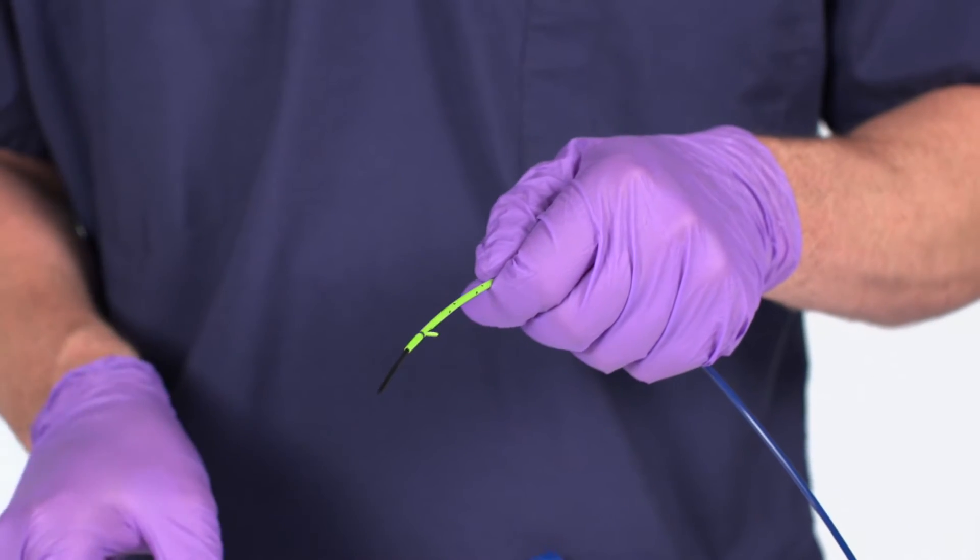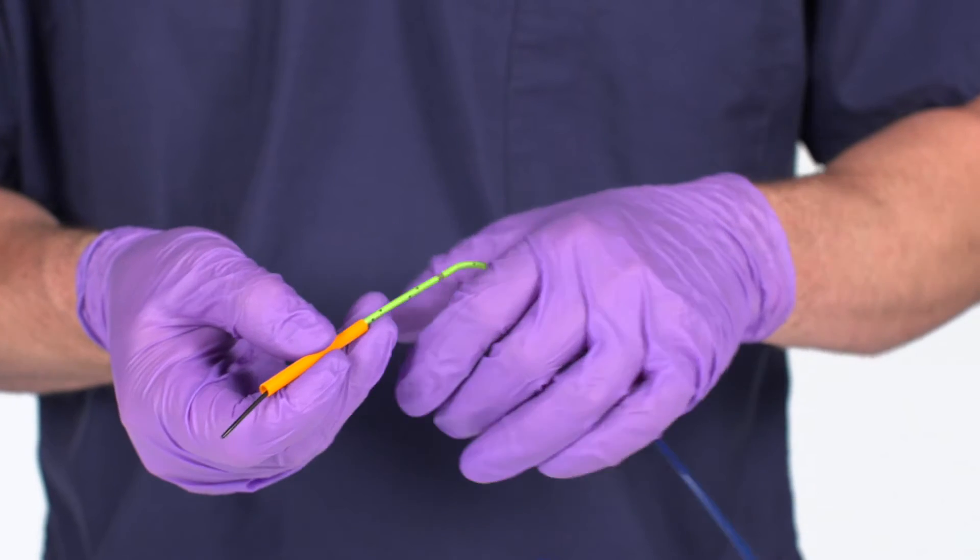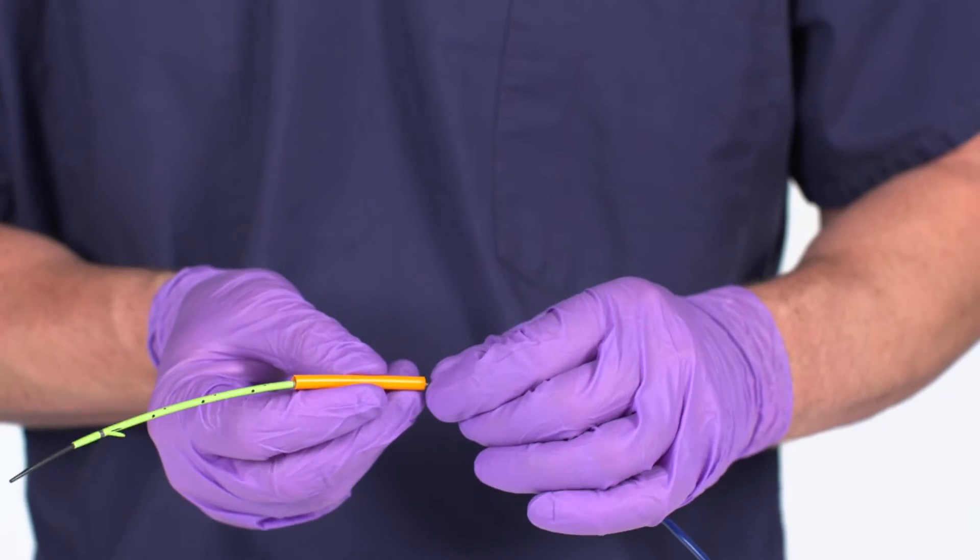For trailing barb stents, slide the stent barb cover so it is on the distal end of the blue push catheter near the stent.